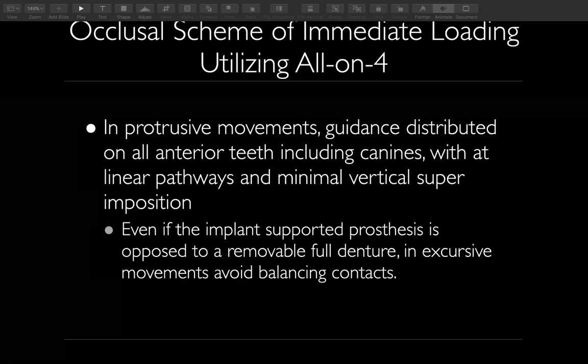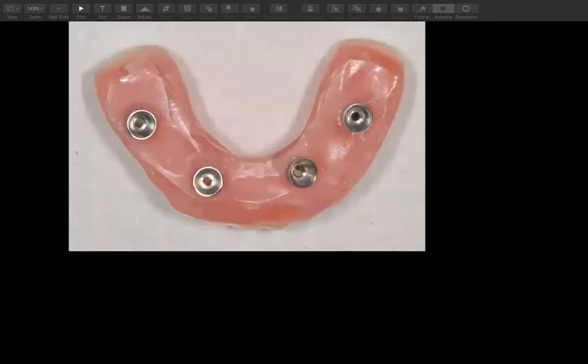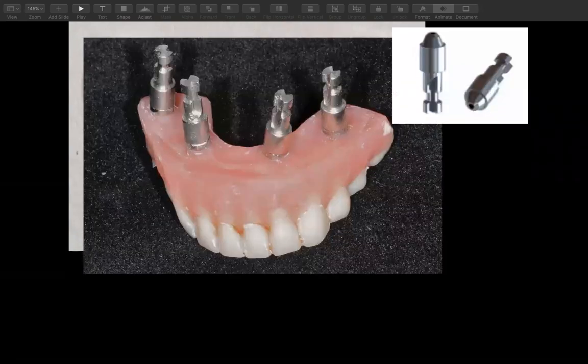You can adjust these temporaries. You want to get these as close as possible. Then once they're ready to restore, if you want to increase the length or adjust or change something, by all means, you have the final to do that. Or you can even take their temporary and make adjustments, contour and shape it, and get that temporary the way you want it for when you're going to make the final. Some doctors will ask me to make a model after we're done with the conversion in case this breaks, and they will break these.